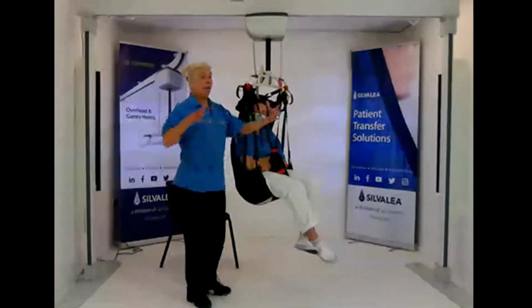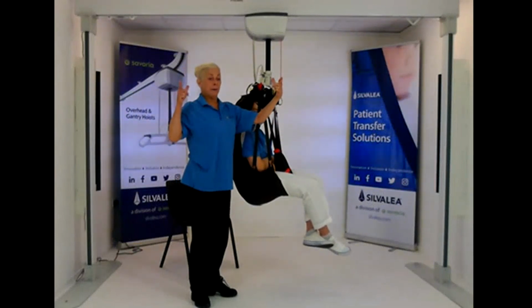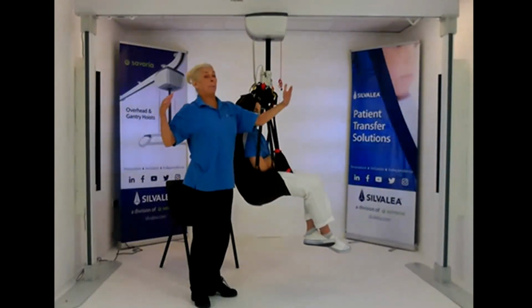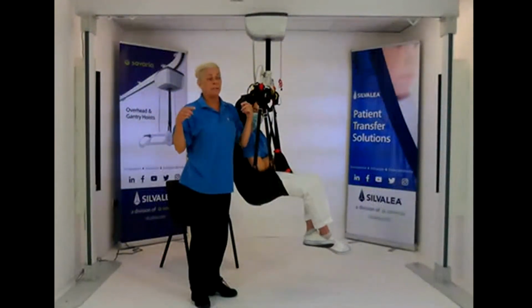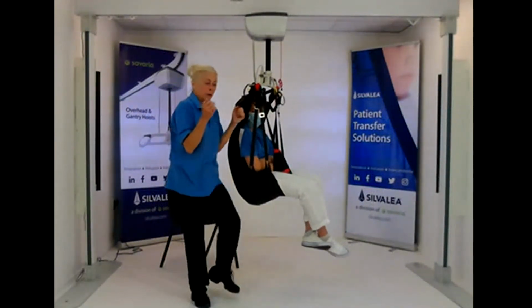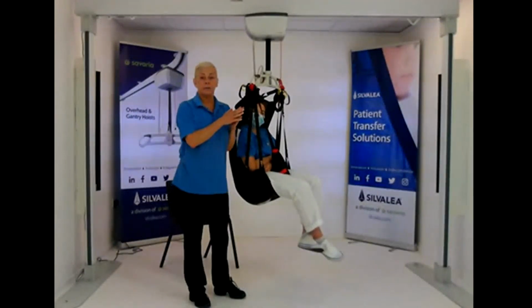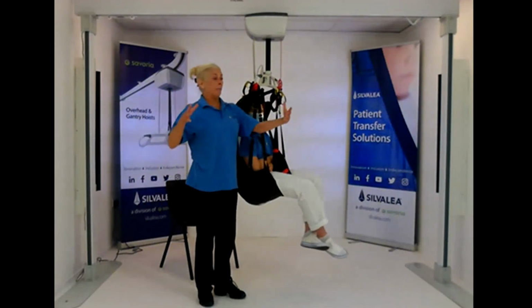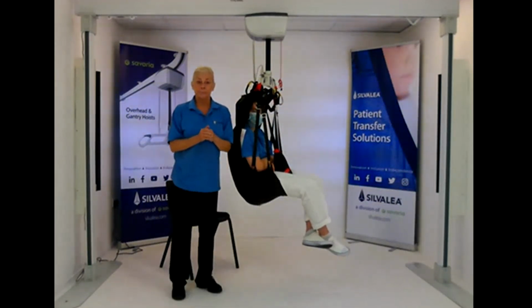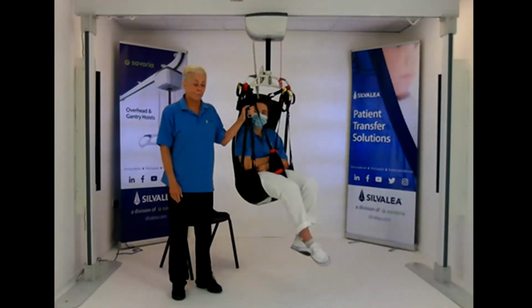The 4-point will open it up. So it opens up the pickup. Will that mean it will open up an extension? Possibly. So it will depend. If you're trying to contain someone and keep them protracted like that, then a 2-point or 3-point's fine. But if you're opening it up, it will just open up the whole body. So you just need to work that out if it is going to open up too much.